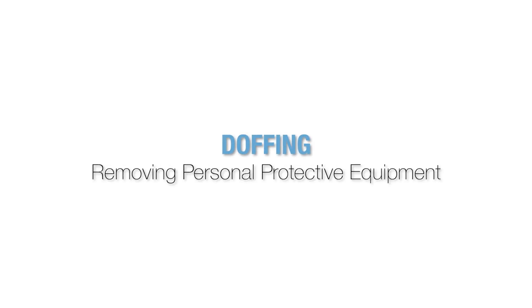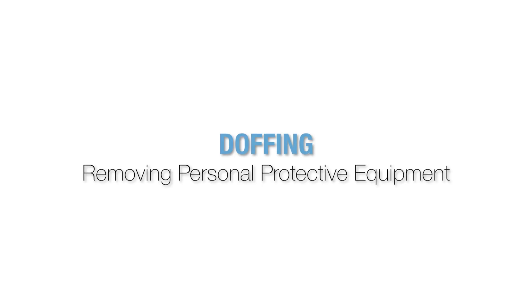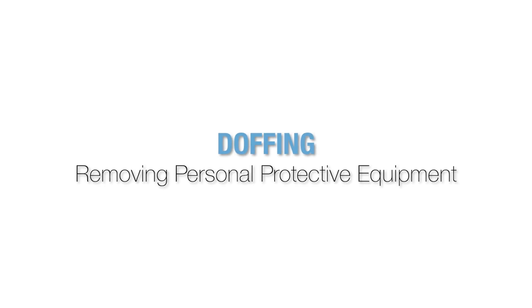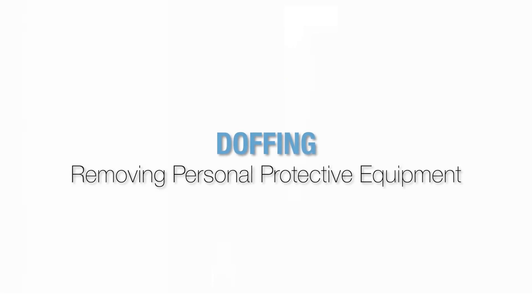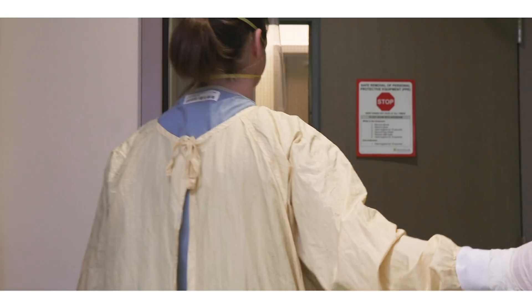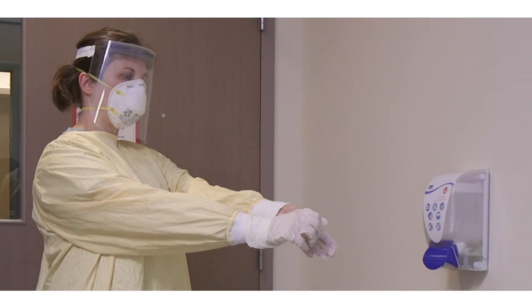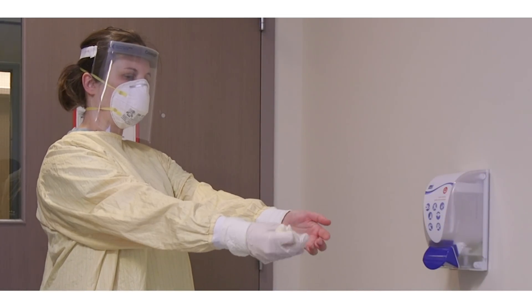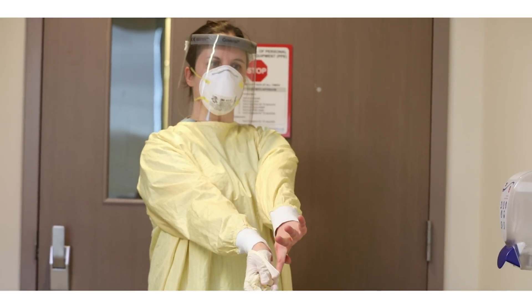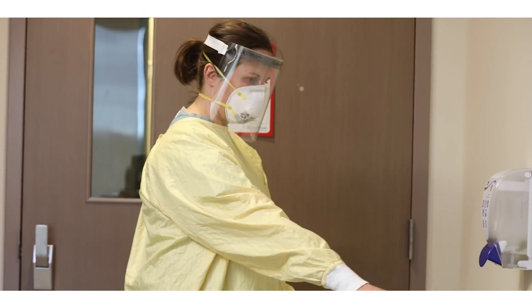The doffing process poses the highest risk of transmission to healthcare workers. Make sure to take your time removing your personal protective equipment. A guide will be posted in the anteroom outlining the steps of PPE removal for staff. Please refer to this guide when doffing your PPE. Step into the anteroom and ensure the door is closed behind you. Remove gloves using the glove-to-glove and skin-to-skin technique and place them in the garbage.